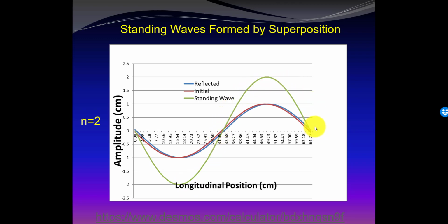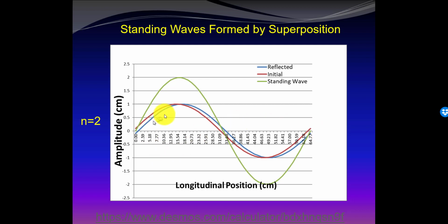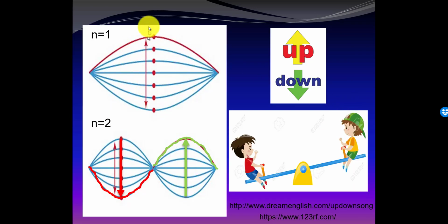And similarly, if we wait a bit longer, we can develop overlap of these waves and a positive lobe followed by a negative lobe. So these waves bounce up and down and are shown in the next slide for what is called the first wave, or the fundamental wave, up and down, and the second wave here. And these work in opposite directions. So as this positive feature goes negative, the opposite happens on this side, much like on a teeter-totter.